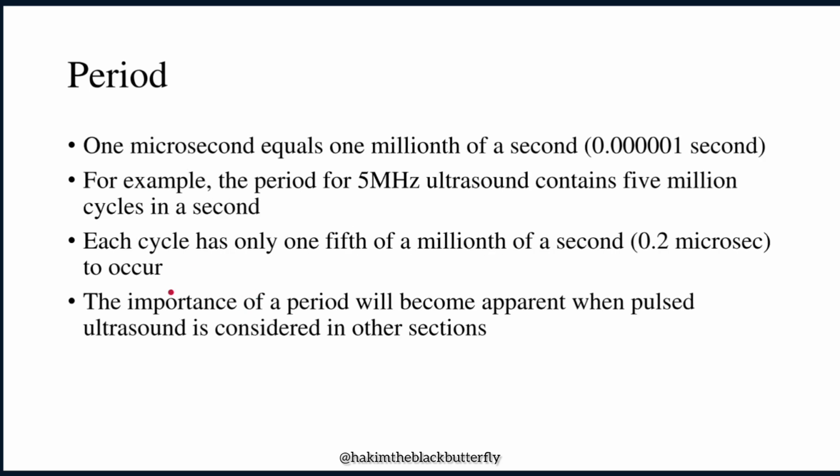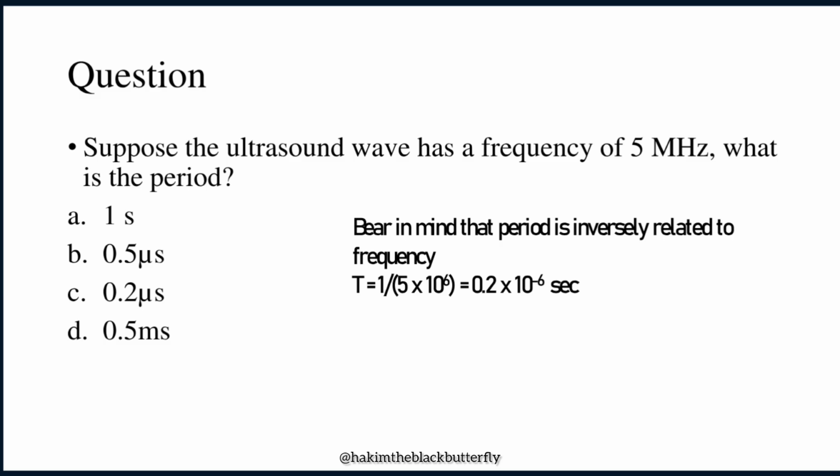All right, so this one talks about period. I will talk more about the period when I'm talking about the pulse echo system. Let me first reserve it for the pulse echo system because it is very important there, and that's what we use it for. So don't get scared. This subject is not for calculation, but in your free time, those who have done math can do the calculation and get the answer here. But I'm not going to talk about mathematics.